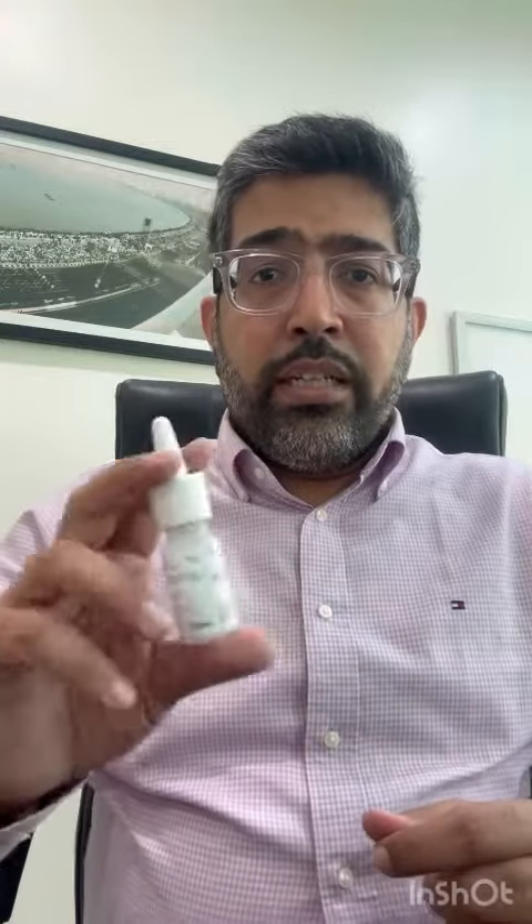Take off the cap. Do not make any holes in this — it is already perforated. The first time you use it, shake it thoroughly and actuate it. Make sure it comes out as a nice mist.